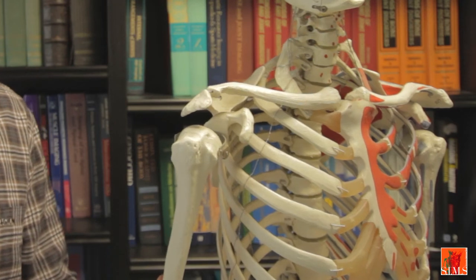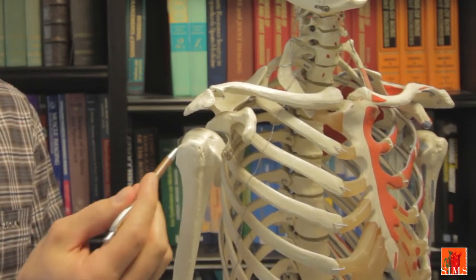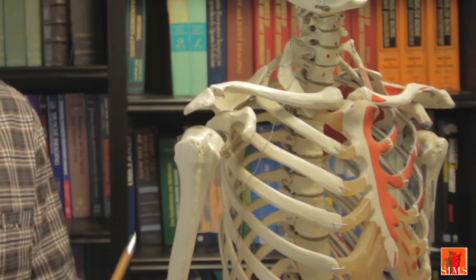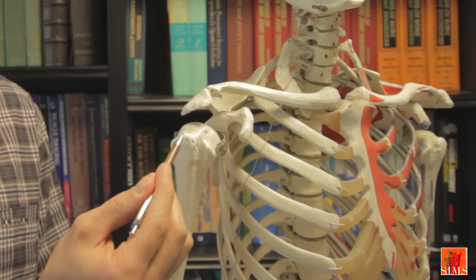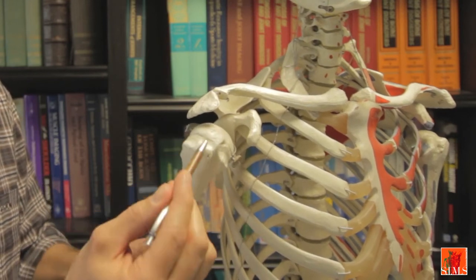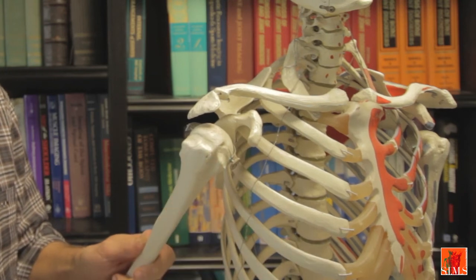It is interesting to observe this anatomy on a skeleton like this one. In neutral position, the greater tubercle is relatively imprisoned under the acromion. In order to make the tendons accessible to the ultrasound transducer, it helps to place the arm in retropulsion in order to free, especially, the anterior part of the greater tubercle in a forward direction.